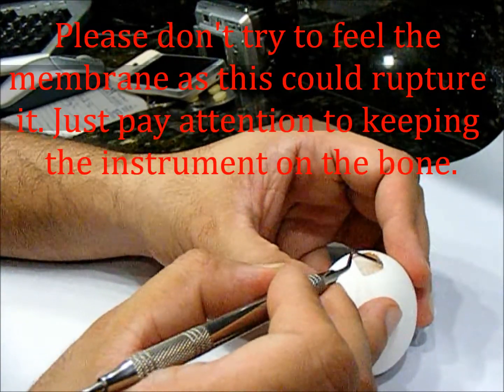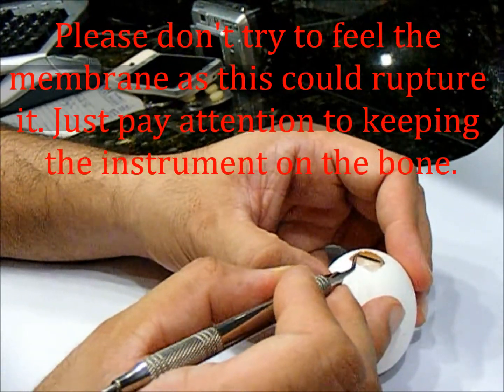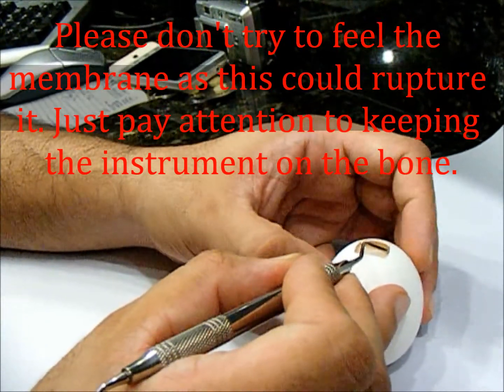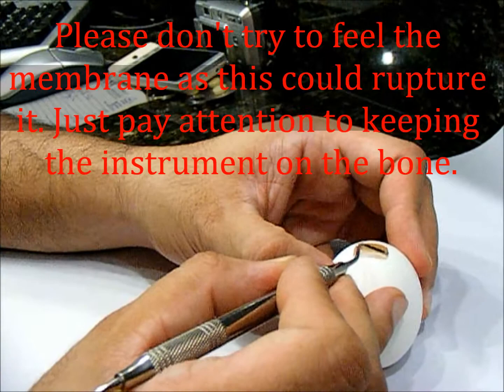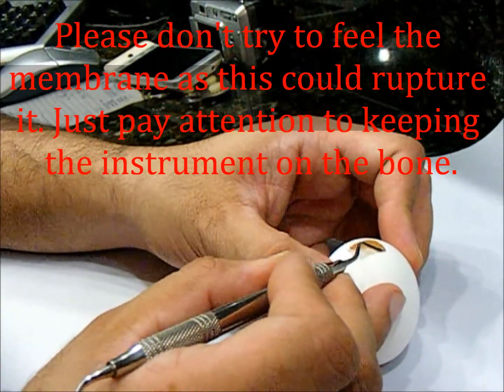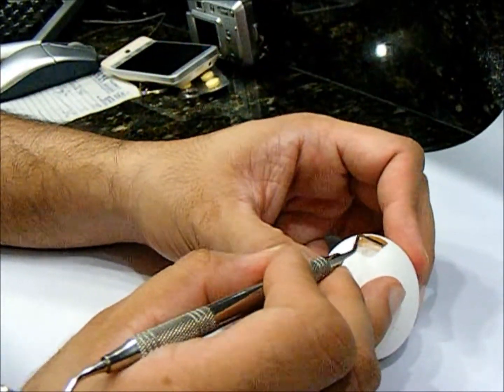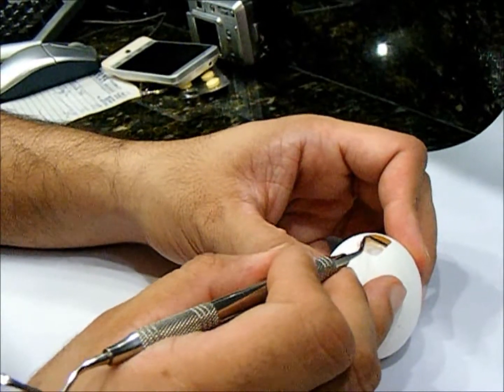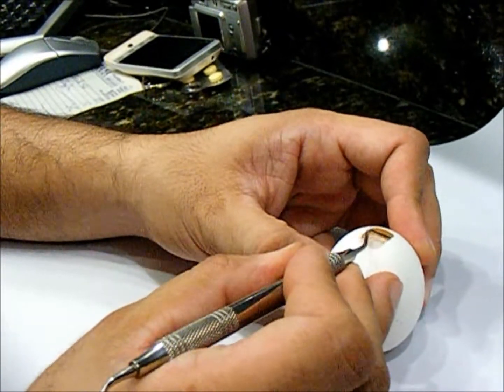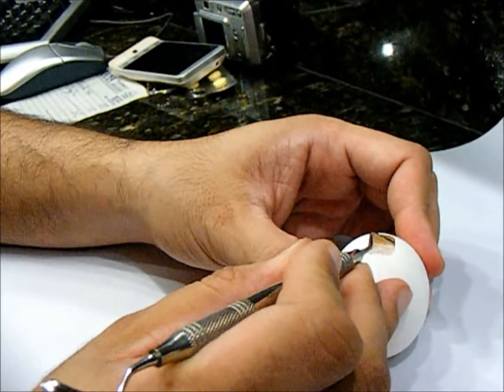Inside the mouth you might see some bleeding at this time, and the bleeding is not necessarily coming from the sinus itself — it is coming from the bone of the sinus. Remember, that is living tissue that was being supplied with blood through the Schneiderian membrane, and those capillaries you are at this moment cutting, separating, and moving off. The coagulum that forms in that space is actually beneficial because you have platelet-derived growth factors, healing factors, and clotting factors being activated by your surgical trauma.